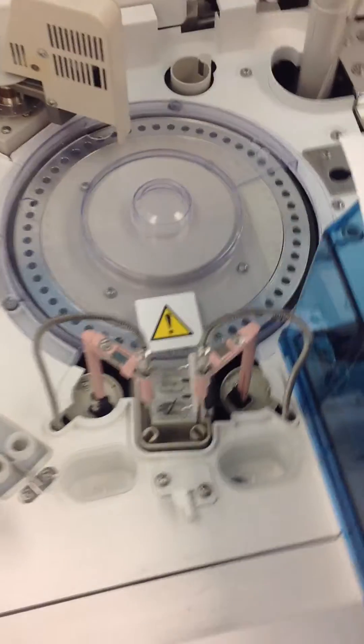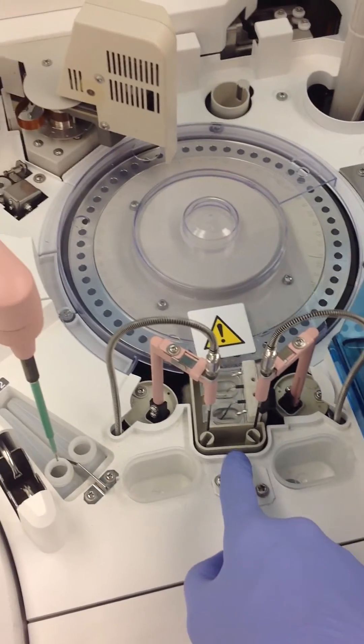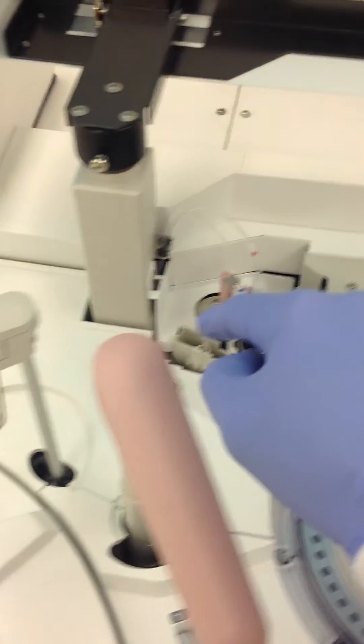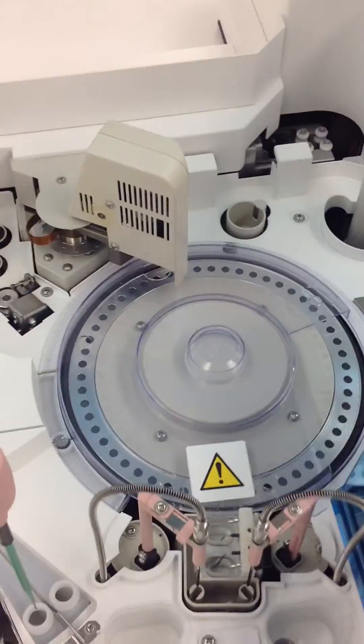Then the rinse stations — like the 501, you're going to use 2% Ecoturge to clean all of the rinse stations, and then follow that with 50 mLs of DI water.